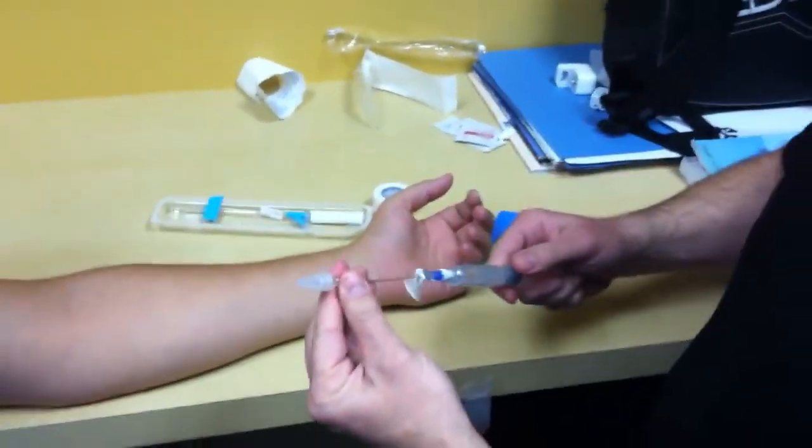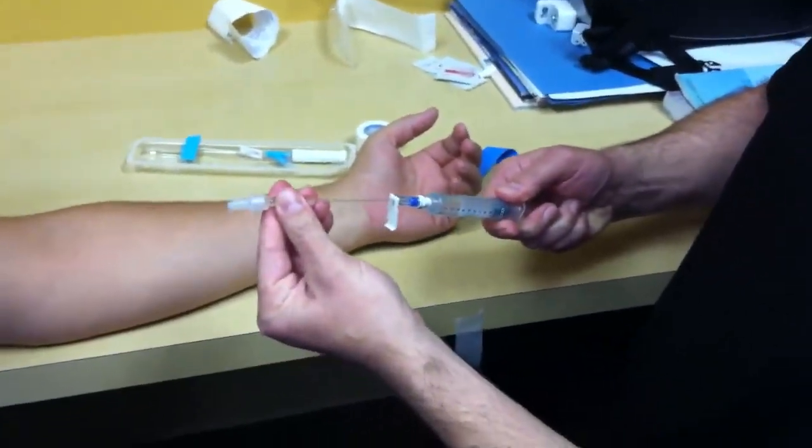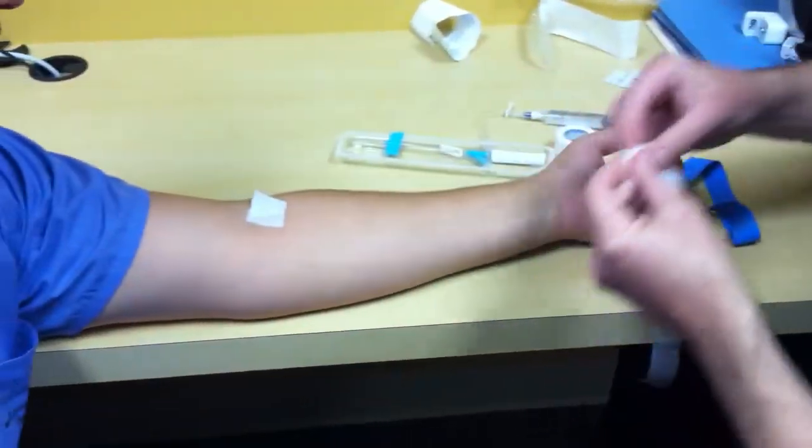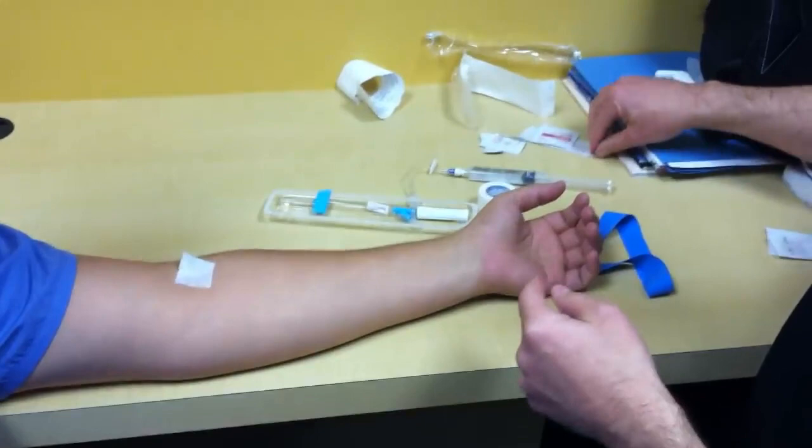Make sure you get all your things ready to go, get the air out of the line. Everything is 100% ready before you expose the needle.